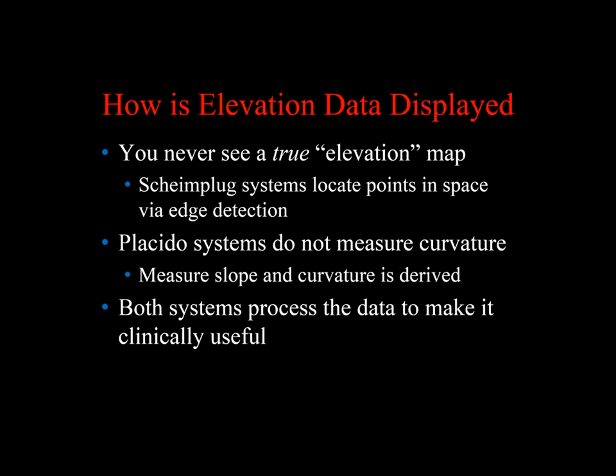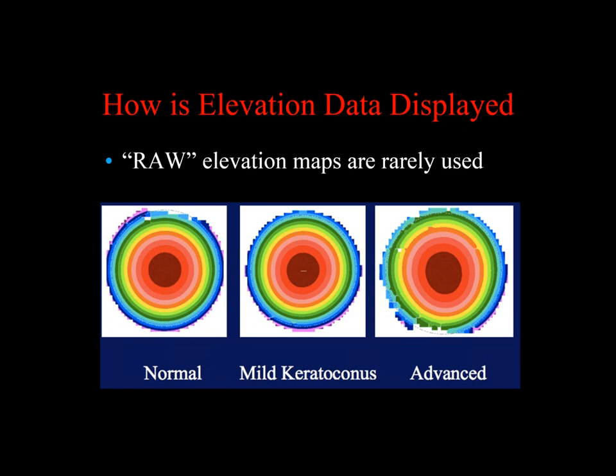Placido systems that I mentioned measure slope. They actually don't measure curvature. Scheimpflugs actually don't measure elevation. They locate points in space. Both systems process the data to make it clinically useful.